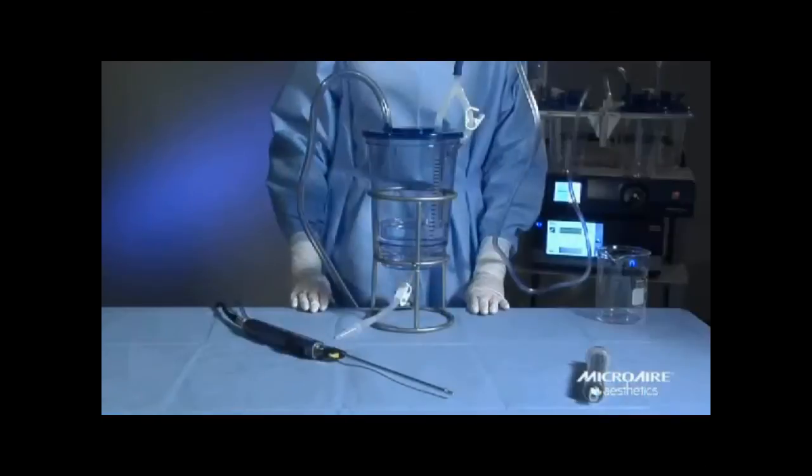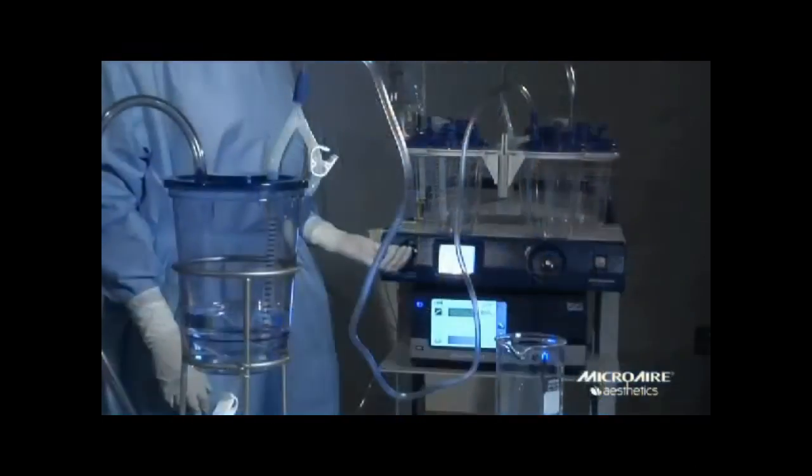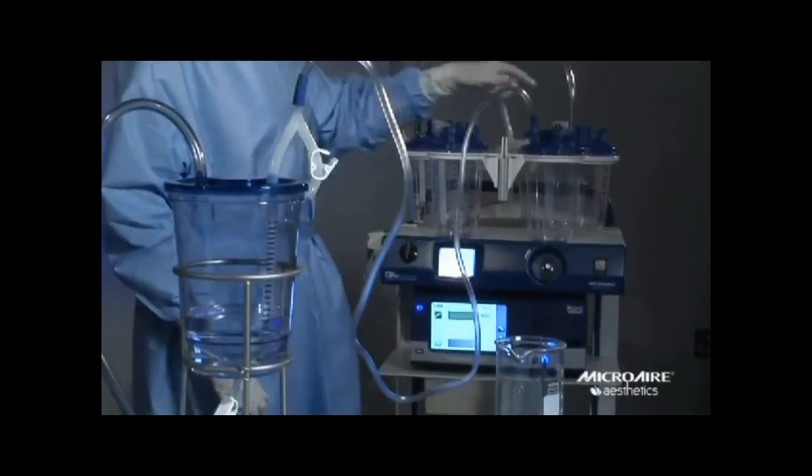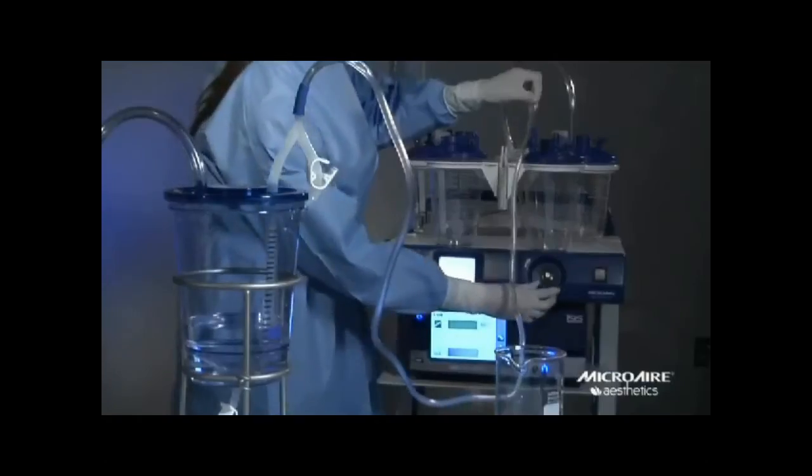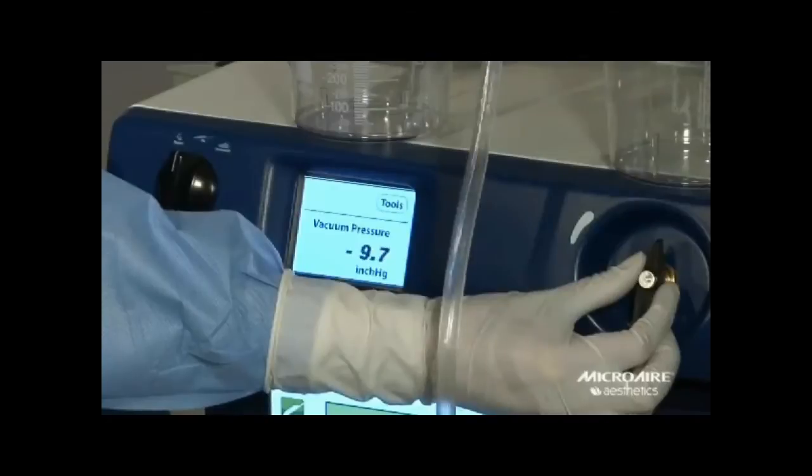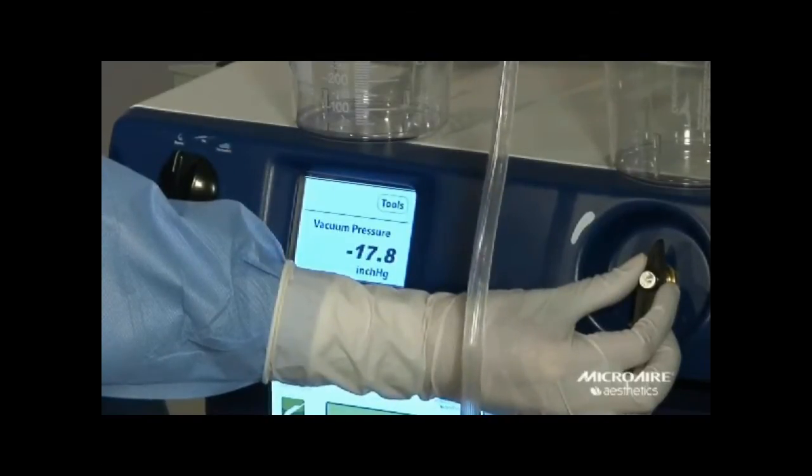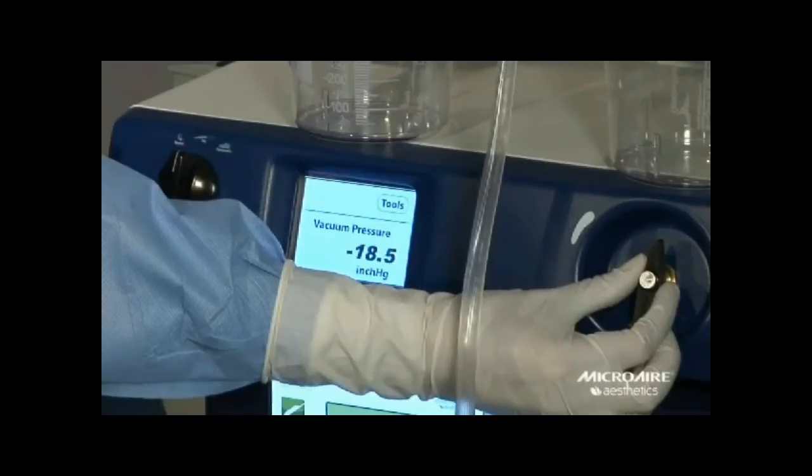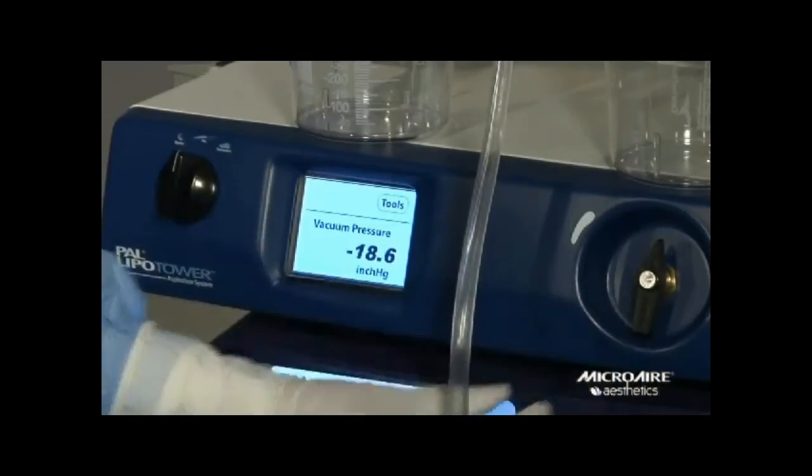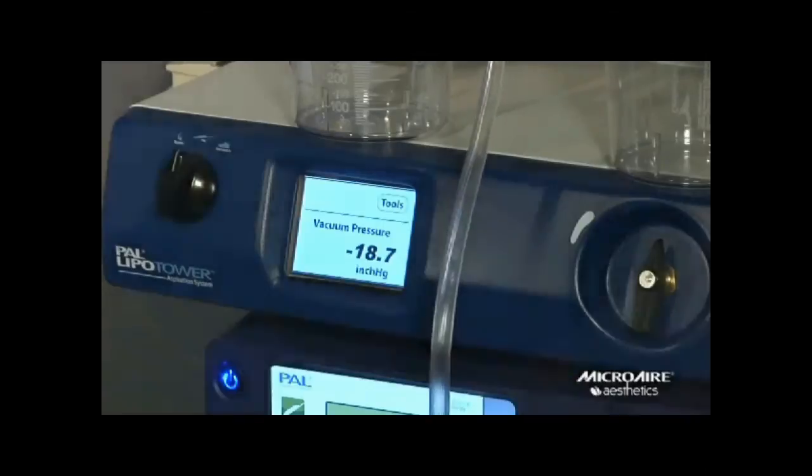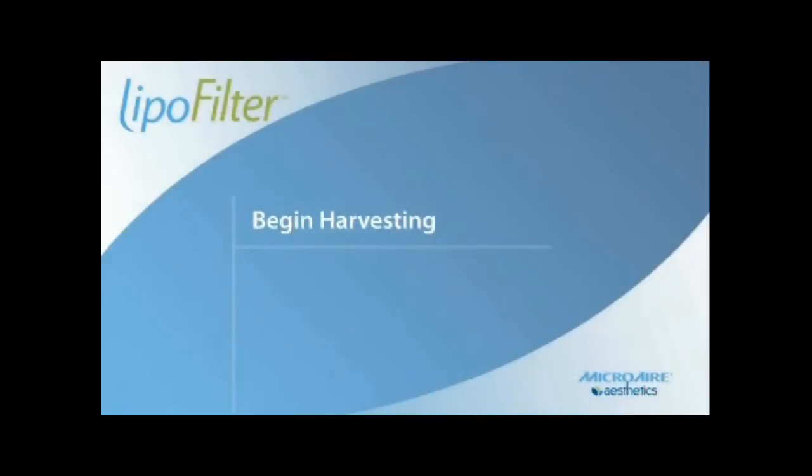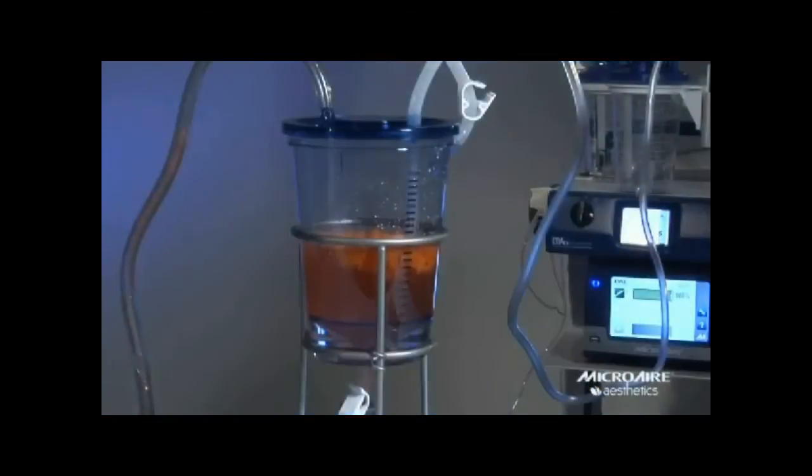The next step is very important. You are going to set your harvesting vacuum level. First crimp your harvest tubing. This closes the system. With your vacuum level turned to the lowest setting, turn on your aspirator and bring the vacuum level up to between 15 and 20 inches of mercury. You are now ready to harvest.